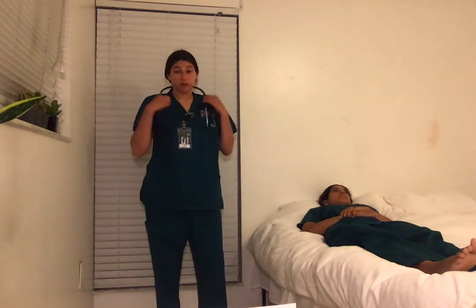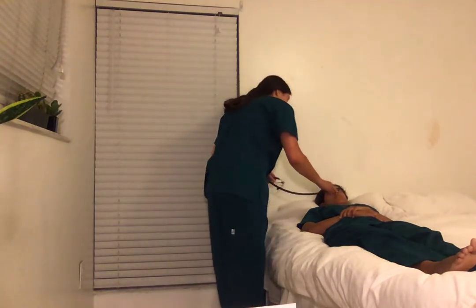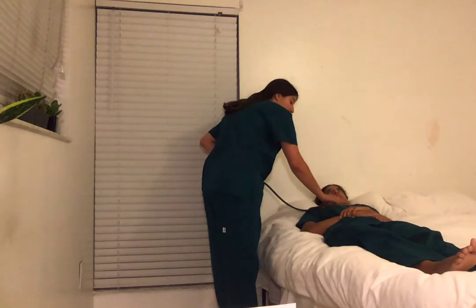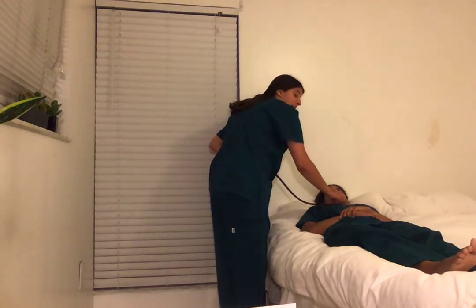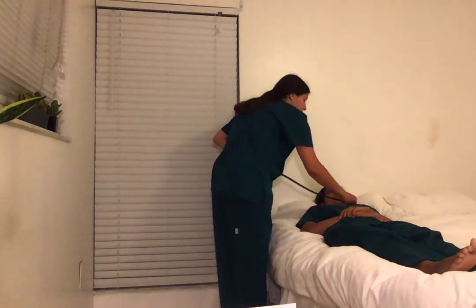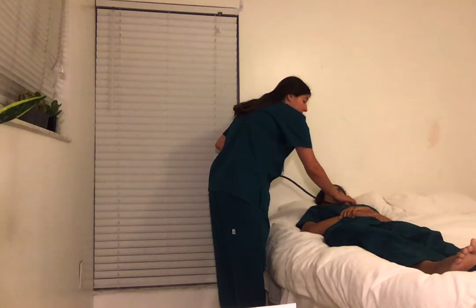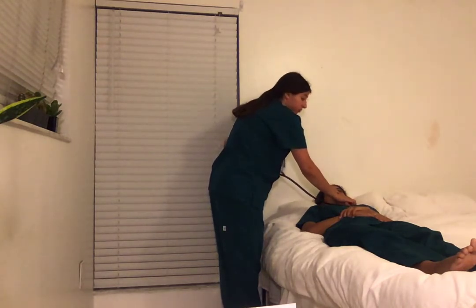I'm going to be listening at each of the valves. So first, I'm going to listen at the aortic valve, which would be on the right side at the second intercostal space. And that would be an S2 heart sound. And now I'm going to listen for the pulmonic valve, which would also be an S2 sound, on the left side, at the second intercostal space.